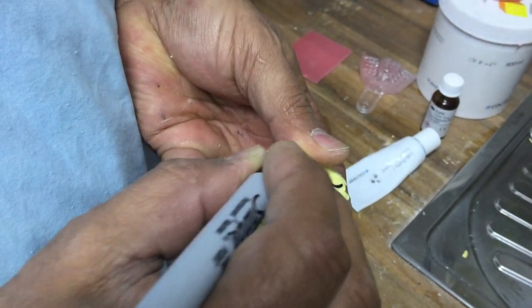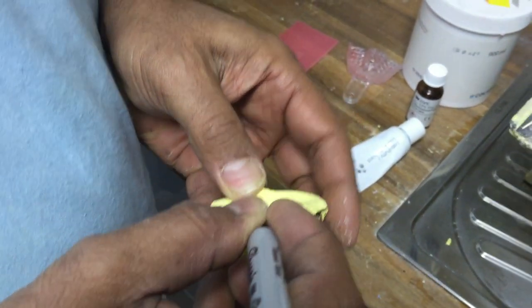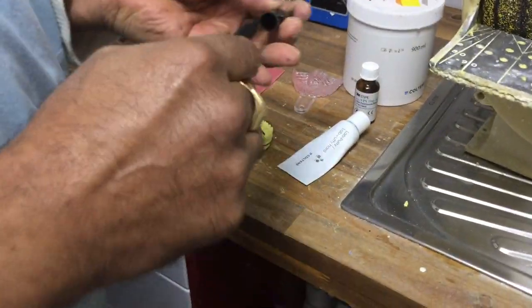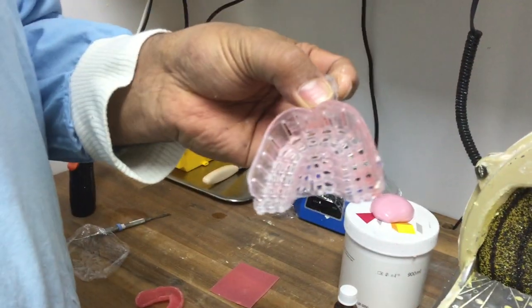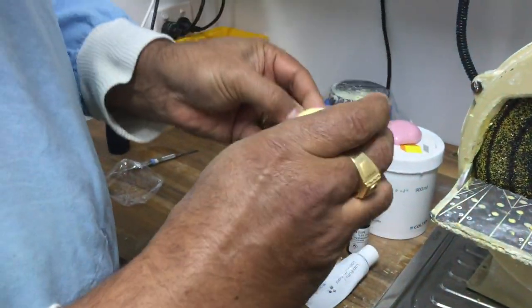That's where the relief is going to be for the wash material. The putty area will help stabilize the tray on the areas that don't have wash material. I don't need to put any stops with this technique, which is really handy. We've got a stock tray and we've made sure it fits — I've already trimmed it at the back so it fits in there nicely.